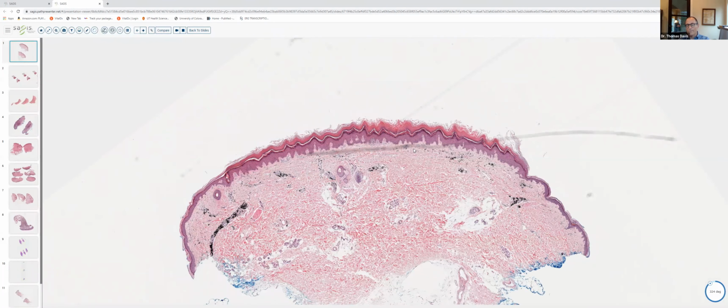And you can see out of the periphery, there's no host immune response, which is a good thing. That's why we inject the intralesional Kenalog. Occasionally, you can see a few epithelioid histiocytes, but generally, there's not much in the way of an inflammatory response. Sometimes, if this material is not so bubbly and real amorphous, it can resemble mucin. You can always do a mucin stain, but mucin will never have this bubbly appearance. And so this is very characteristic of intralesional Kenalog or steroid.